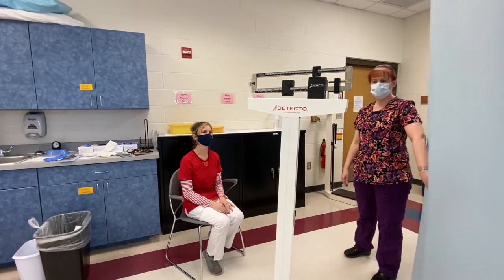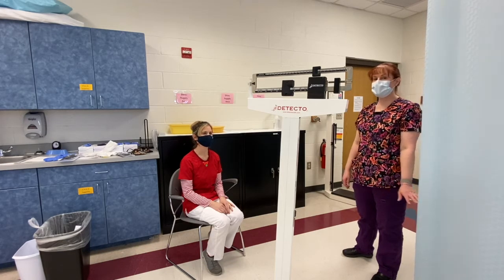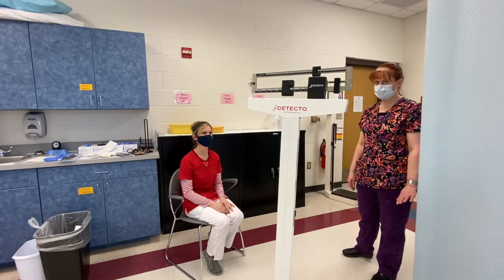All right, I'm now going to demonstrate measuring and recording the weight of an ambulatory client. Your client can walk, so the gait belt is not required for this skill.